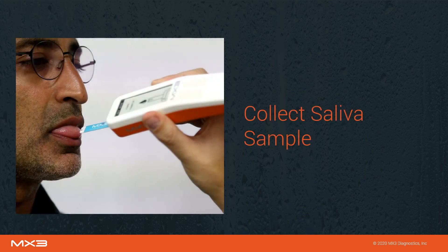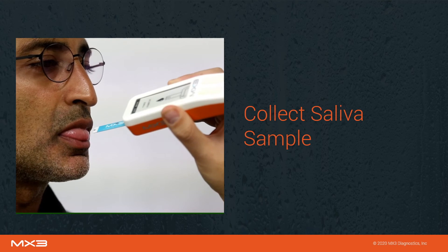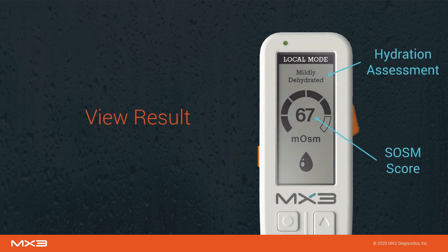Collect a saliva sample by lightly tapping the tip of the test strip against the user's tongue. Once enough saliva has been collected, a tone will sound. Typically, this will take between five and ten seconds. After a few seconds, the result will be displayed on the MX3 lab. Both a hydration assessment and a raw salivary osmolarity score will be displayed.